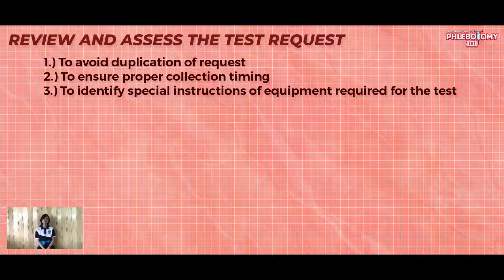1. To avoid the duplication of the test request. 2. To ensure proper collection timing. And lastly, to identify the special instructions or equipment required for the test.